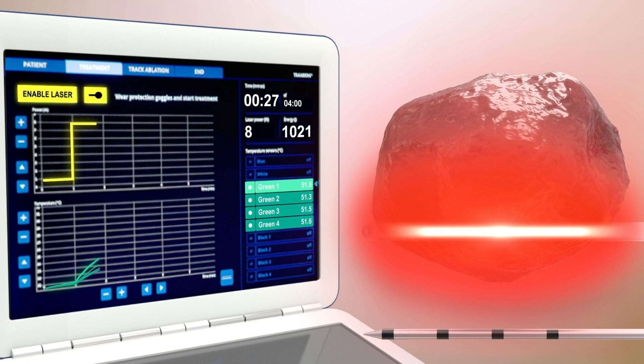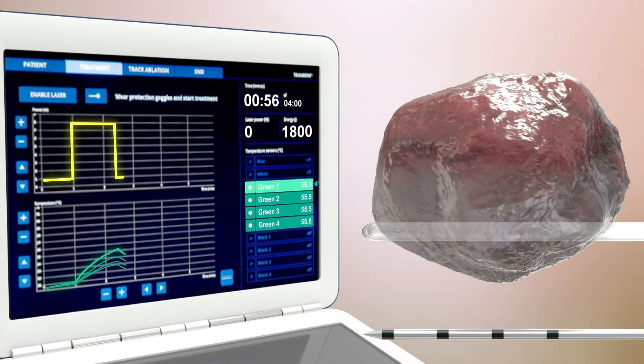Target temperatures are monitored in real-time using the temperature probes. Instant cell death is achieved at 60 degrees Celsius.